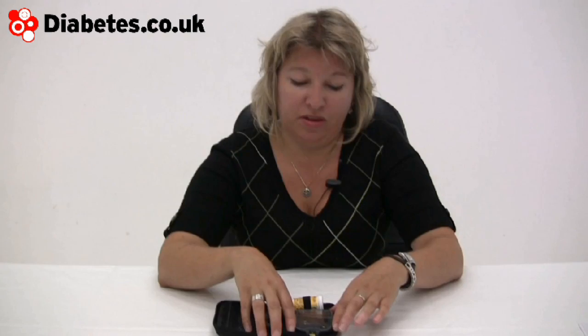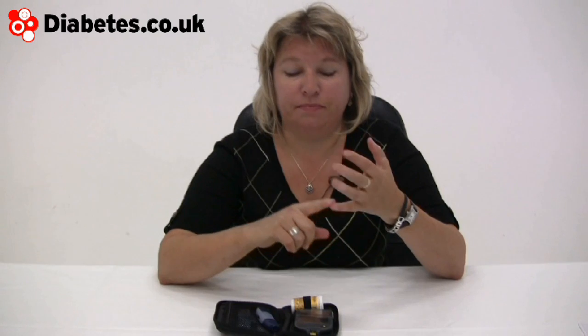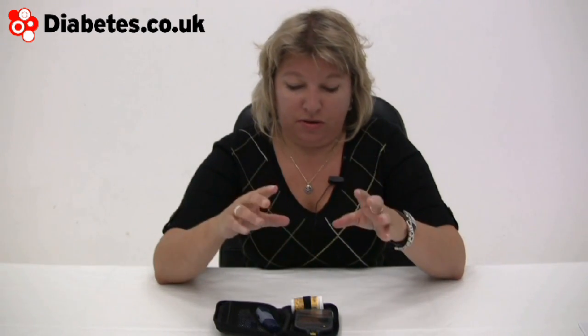This meter, and some others out there — notably the AccuChek Expert from Roche — help you keep track of carbs and do some of the maths, using an algorithm inside the meter based on your insulin sensitivity and insulin-to-carbohydrate ratio to give you advice on what dose to give yourself. There are other videos on this site about insulin sensitivity and carbohydrate-to-insulin ratios if you want to explore those further.